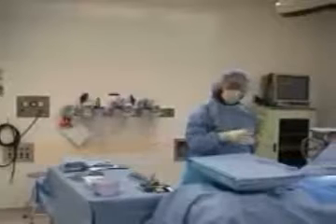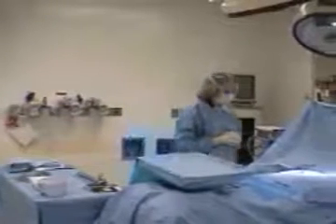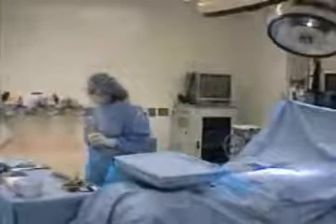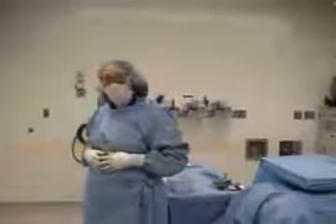Notice that the sterile field is defined by the horizontal surfaces — in this case the patient, the top of the mayo stand, and the top of the back table. Notice that I'm not moving my hands way back out of my line of vision; they're always in front of me when I move. Keep your hands where you can see them and folded when you're not holding a retractor or assisting the surgeon or nurse. When you move around the field, you always face the field. This may feel strange at first, but it's very important because the only part of your gown that's sterile is the front part. If you turn the unsterile back of your gown toward a sterile field, you can't see what you've touched, and it would be considered that you contaminated the field.